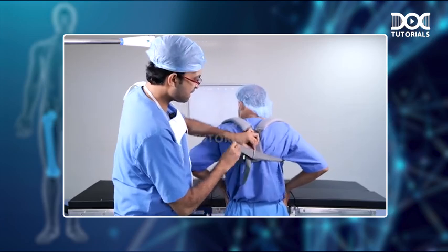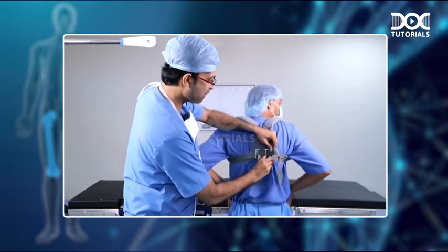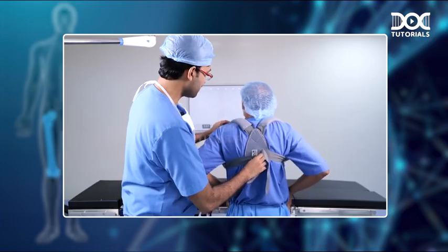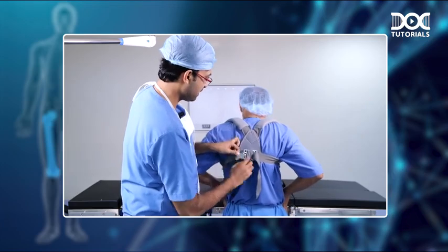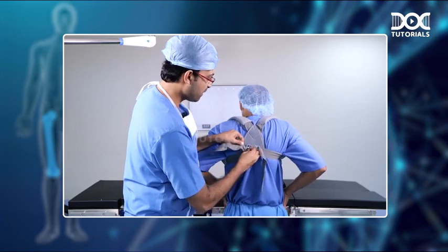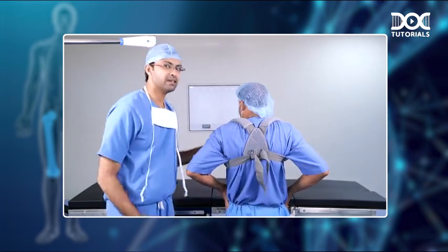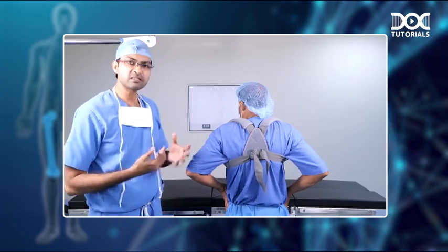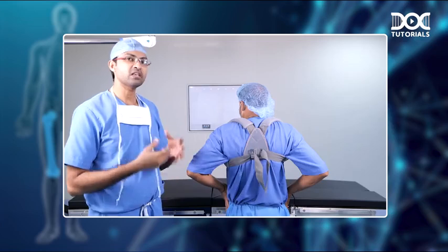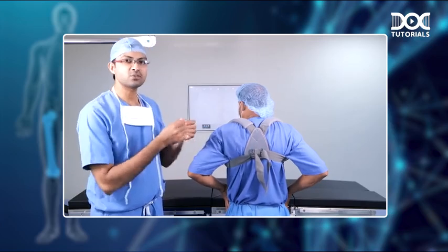Make sure that it is as tight as possible. If it is loose, it is not very useful. Make sure it is as tight as possible. So if you feel that one side is loose, you can always correct it and make it tight once more. And you should also make sure that the patient tightens the brace every day, because whenever the patient is sleeping, obviously there is a chance that the brace can become loose, and every day the patient should make sure that it is tight. You should teach the patient to tighten the brace.